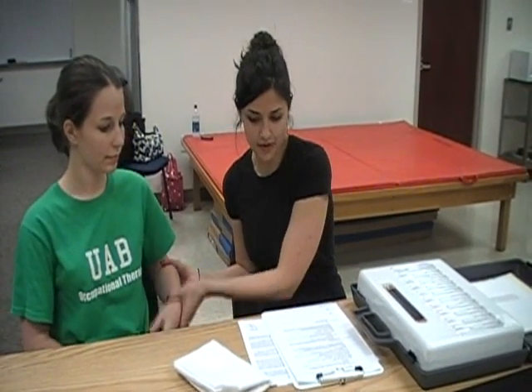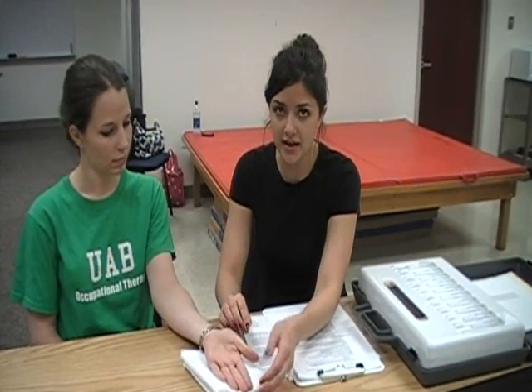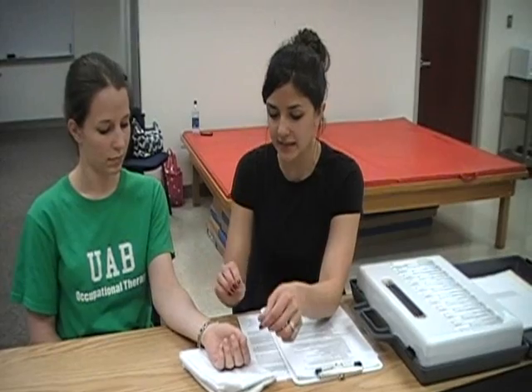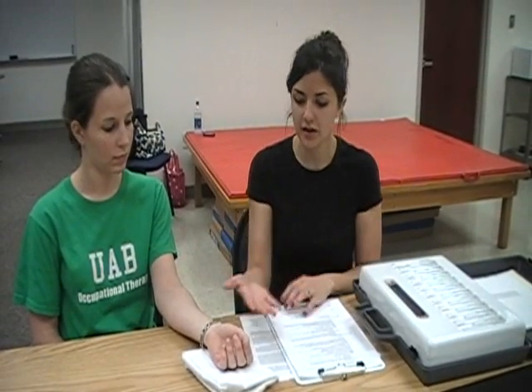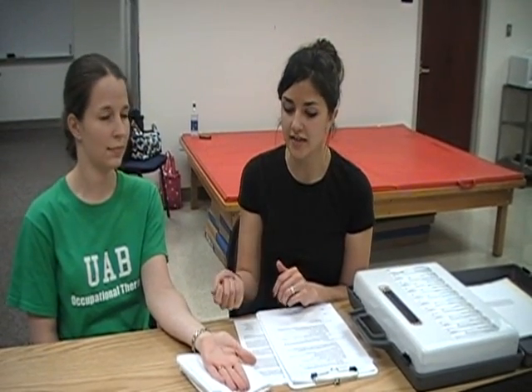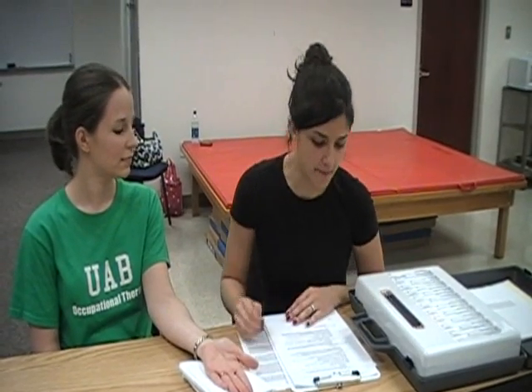You want to start off with the client seated next to you and their hand placed on a surface — either putty or a rolled-up towel — so that you don't have to hold them to stabilize their hand. Go ahead and flatten your hand. You're going to want to occlude their vision during the testing so that they can't see when you're testing them.